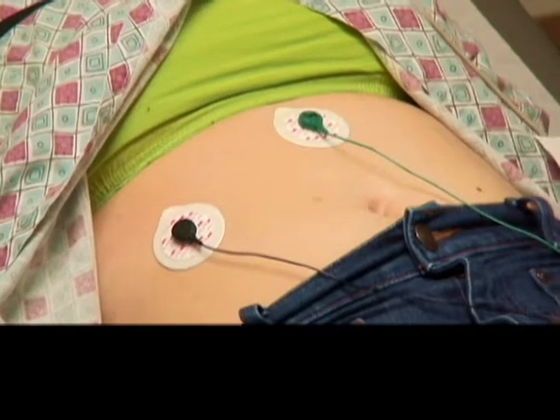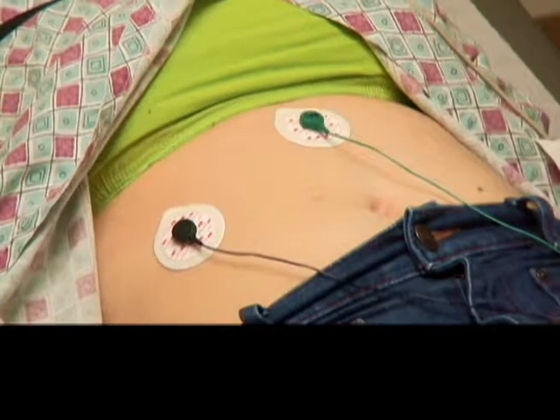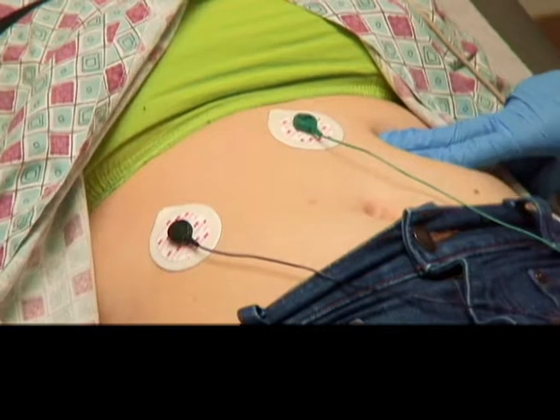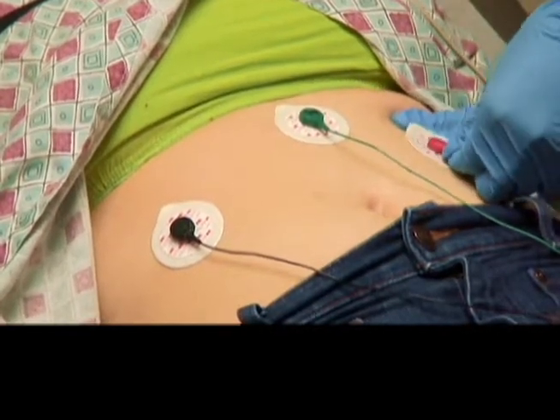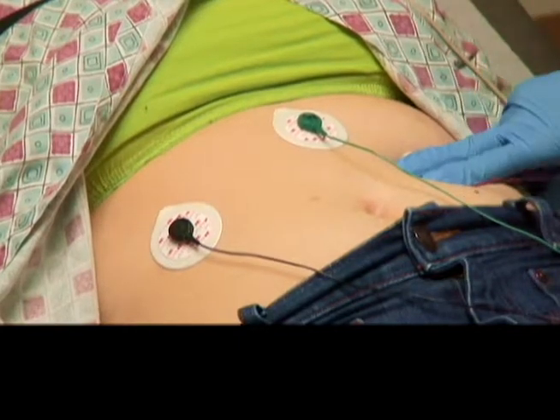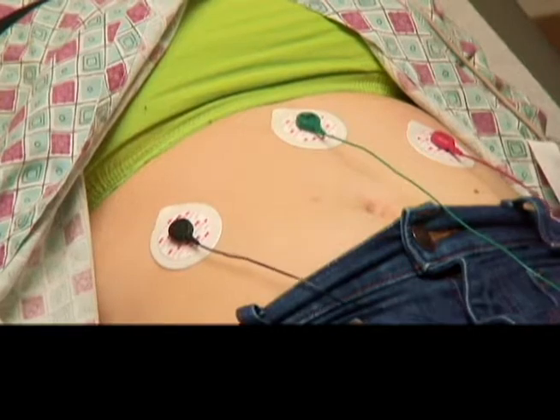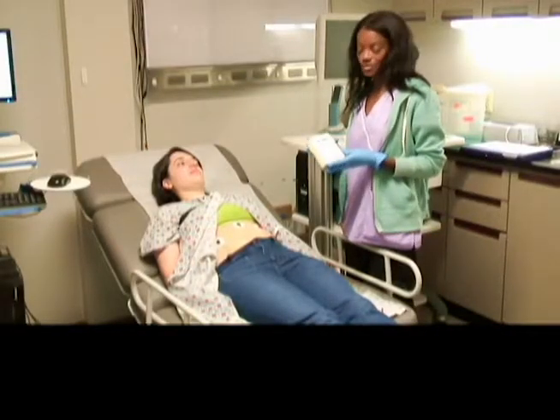Lastly, the red one, which is the left. Same placement, but on the left side. We're going to feel for the rib, 2 finger lengths down, mid-clavicle, and place the lead. That's it for that. Alright, now we're going to go ahead and secure the wires into our module.